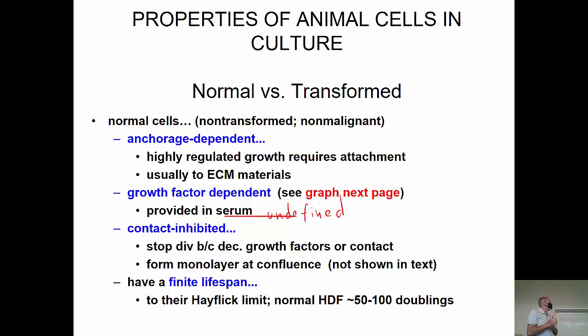Yes? How do you provide a serum and not know what's in it? So like, where do you get the serum from? You just buy the serum. You buy it in big containers, and then you just add it in. We'll see the recipe for one set of media in a few minutes.